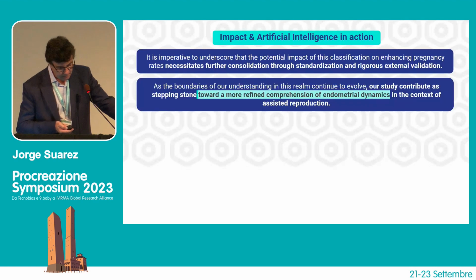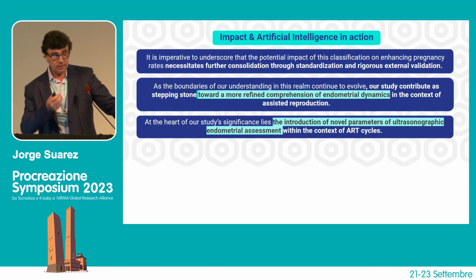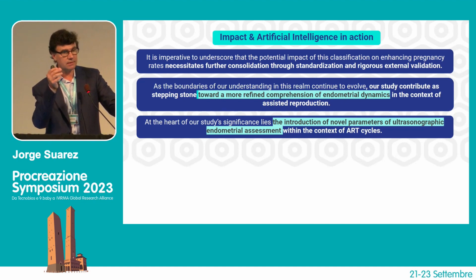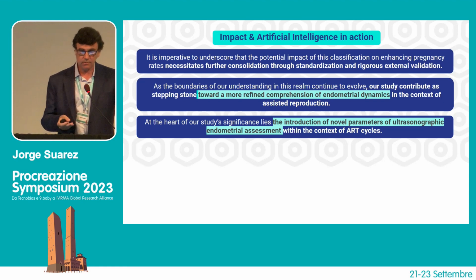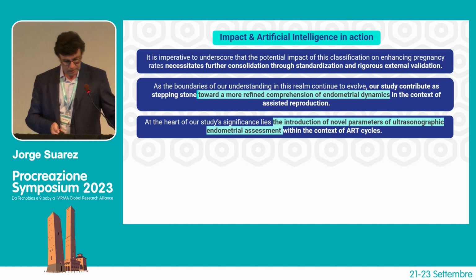At the heart of our study lies the introduction of a novel parameter. The novel parameter is how the external layer contributes to the pregnancy rate when we do ultrasonographic endometrial assessments.